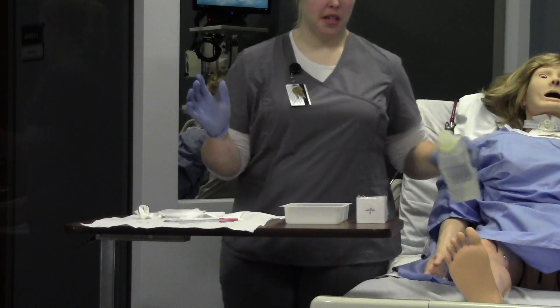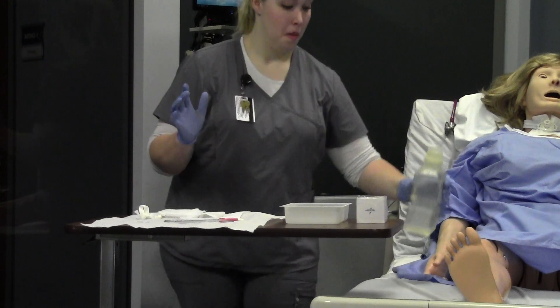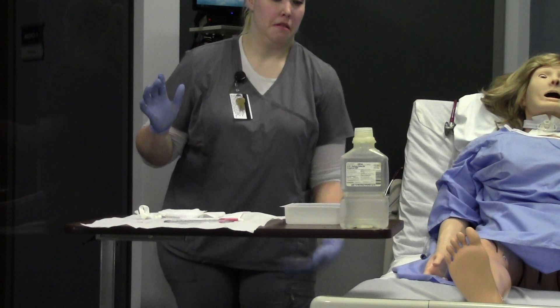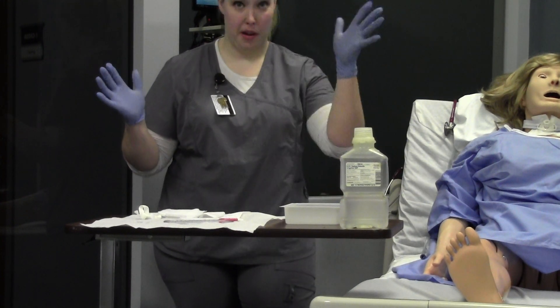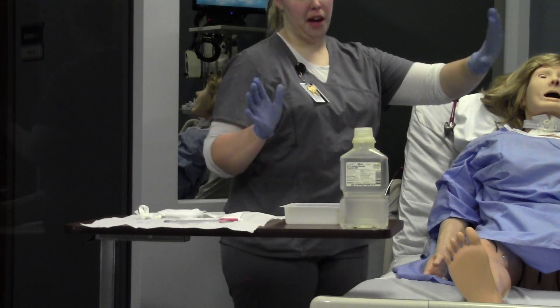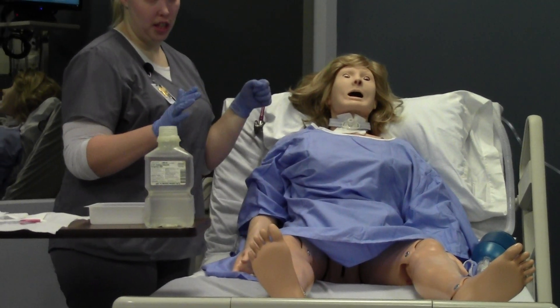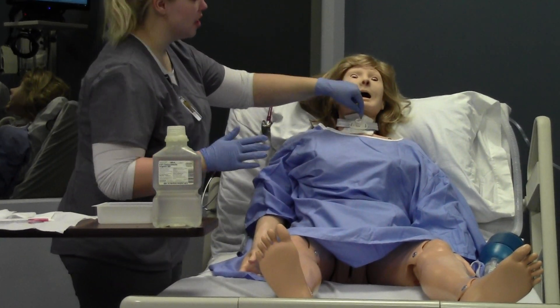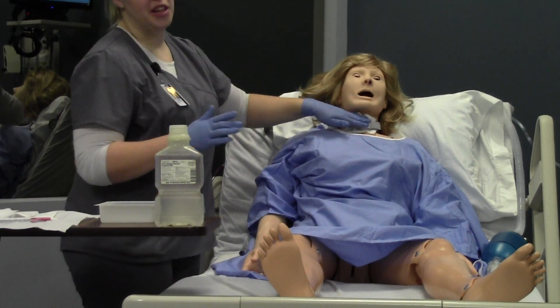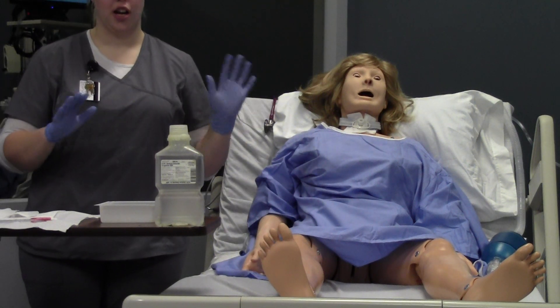I'm going to fill my containers with saline and set it back to the side. With my non-dominant hand, I'm going to unlock the trach. On your patients in the lab, they have a little loop — you're going to hold on to that loop. We're going to suction our patient first and then go ahead and remove our inner cannula.